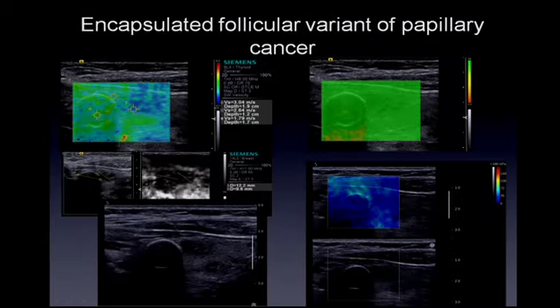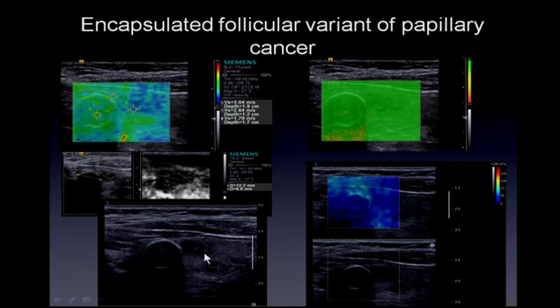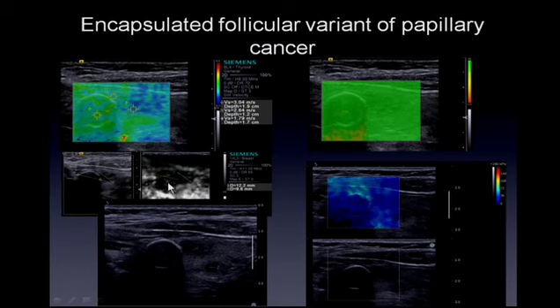This is an unusual case of an encapsulated follicular variant of a papillary cancer. On B-mode imaging, you can see eggshell calcification surrounding the lesion, which is slightly hypoechoic to normal thyroid. On strain imaging, the lesion is hard, and there's actually a second hypoechoic lesion adjacent that is also hard. The eggshell lesion is the papillary cancer. The adjacent lesion was benign, demonstrating the problem with strain imaging when just looking at color maps, as both the malignant and benign lesions have similar characteristics. A strain ratio was not obtained in this case.